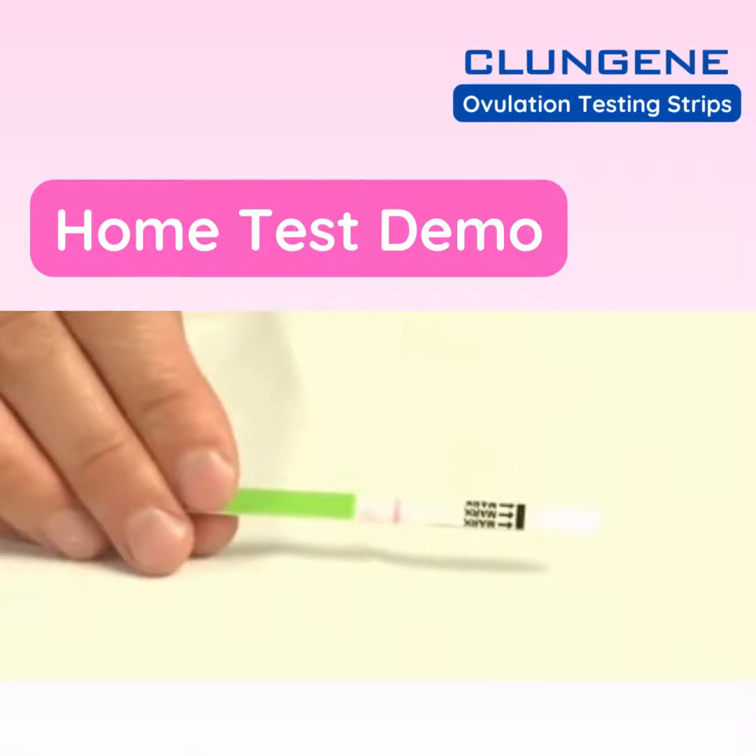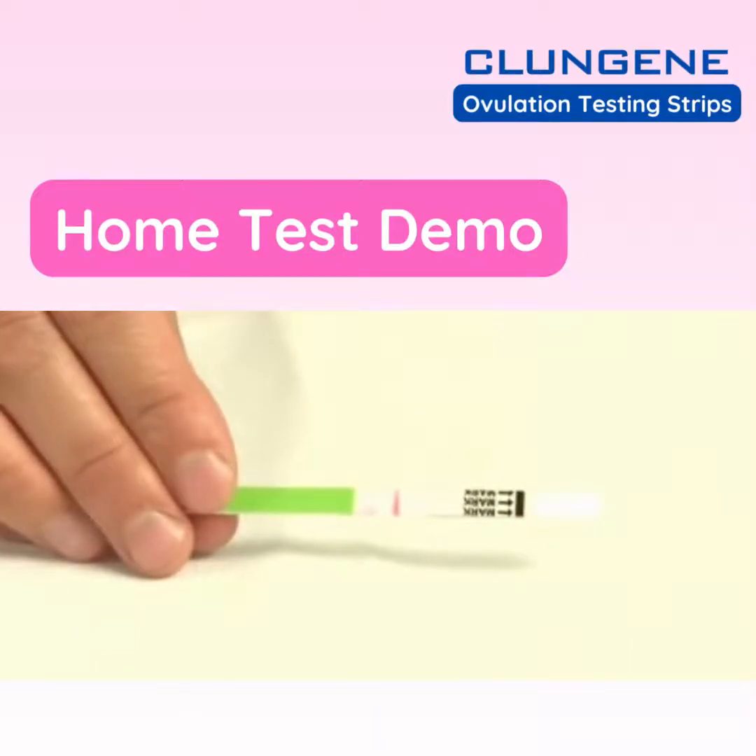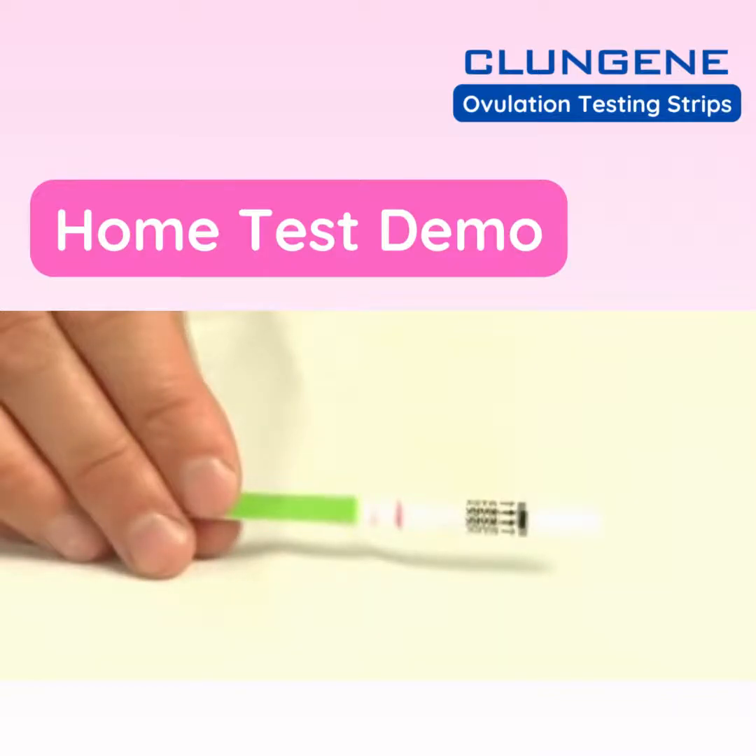The test instructions indicate that you should hold the test in the urine sample for about 10 seconds. Our personal preference, however, is to hold it in the sample until you see the dye begin traveling up the test. That usually happens within 10 seconds.